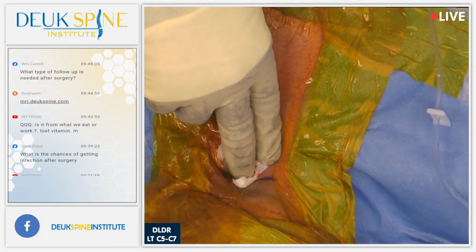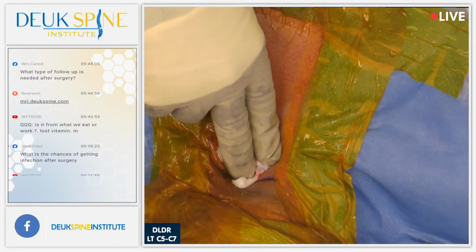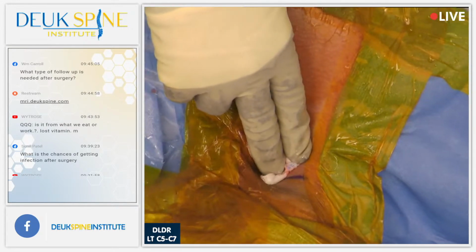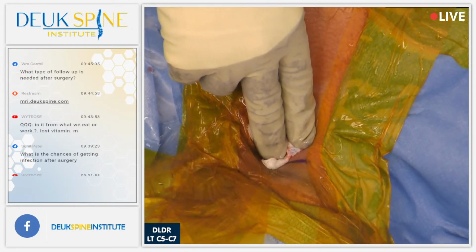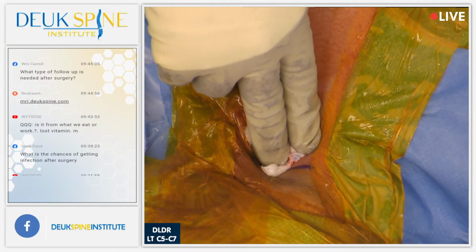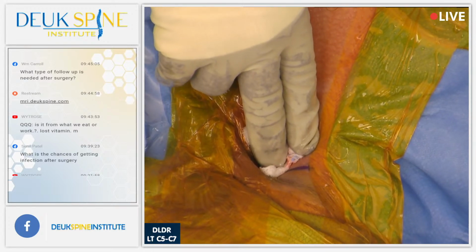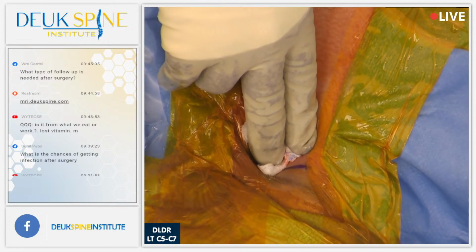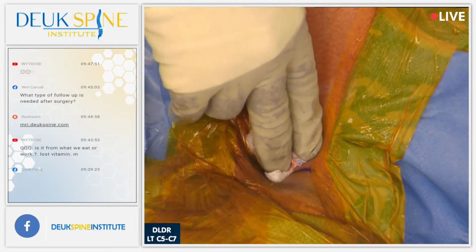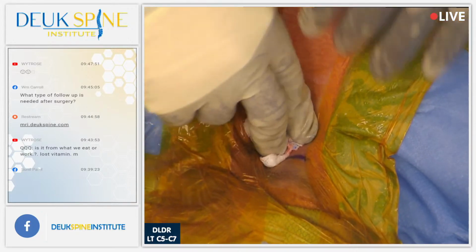If you watch me, it looks kind of haphazard because I'm talking and seem distracted, but there are actually very specific little things that I pay attention to during the surgery that have to be perfect. One of them is blood pressure control, right? And then of course, placement of the needle in the beginning is very important. And of course, moving the dilator along the front of the spine is very important. You have to do it just right. All right, let's take a look at the incision. You ready, Henry?